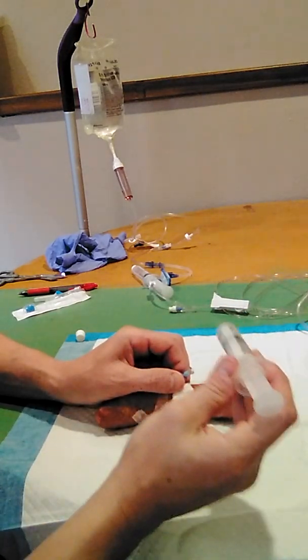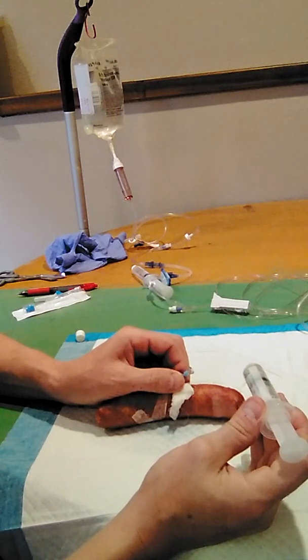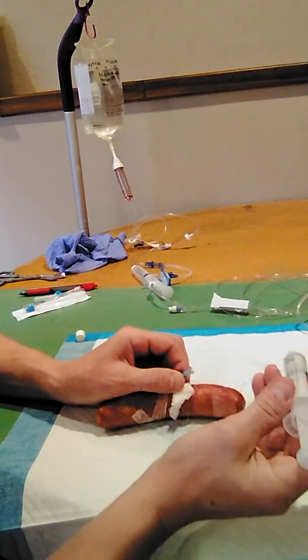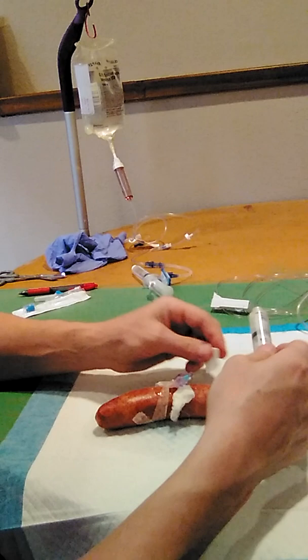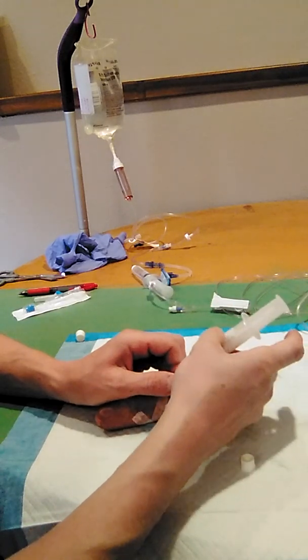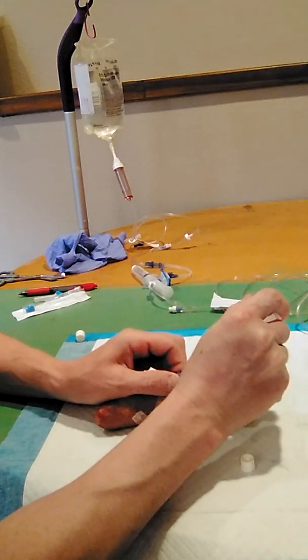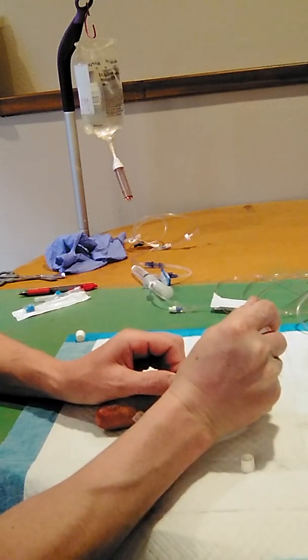Now I'm going to administer the medication that is specified in the order, and I'm checking it on its vial. And cleaning the hub and the medication syringe. Okay.